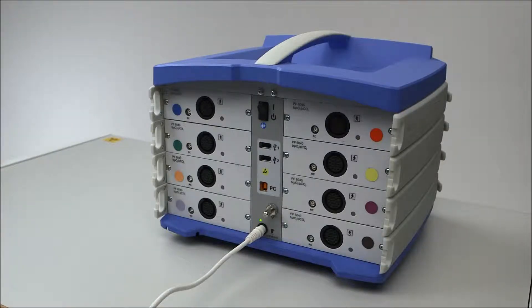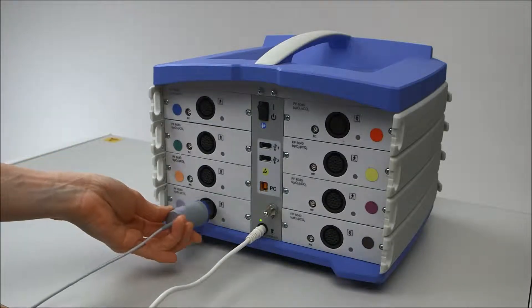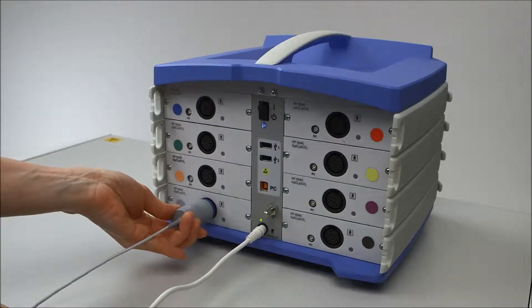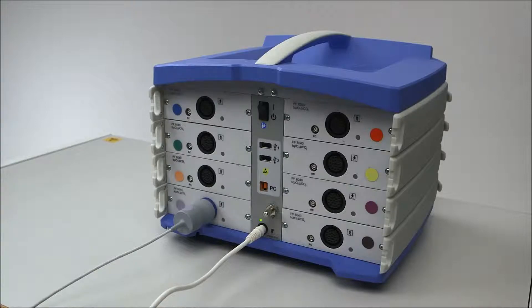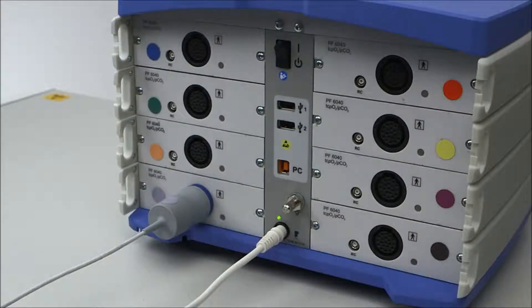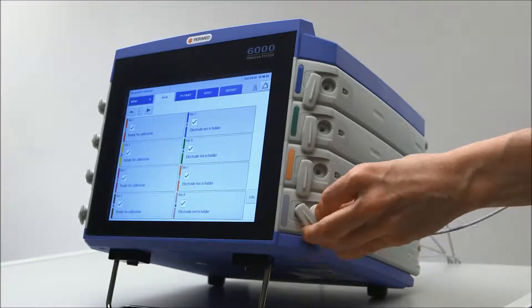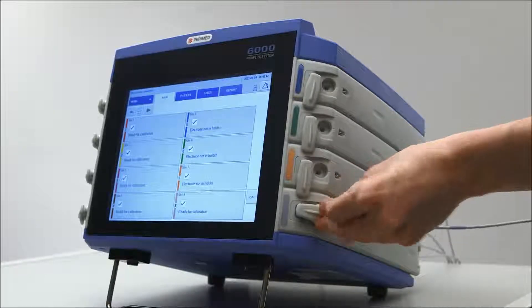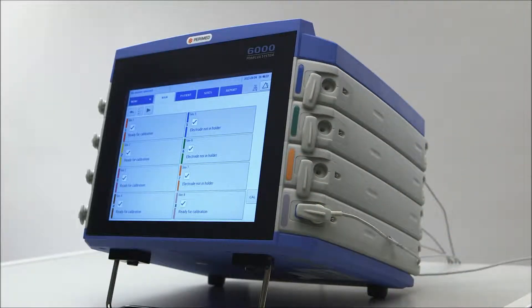Start the Periflux 6000 by plugging the electrode into the socket at the back of the instrument. Make sure the color coding of the cable matches the color coding of the socket. Then place the electrode head in the holder and secure it with the lock.